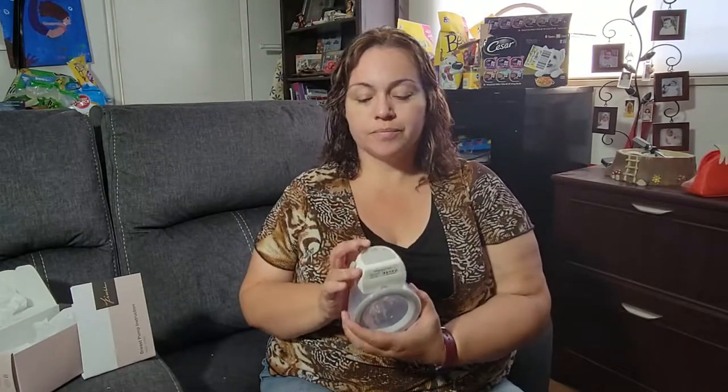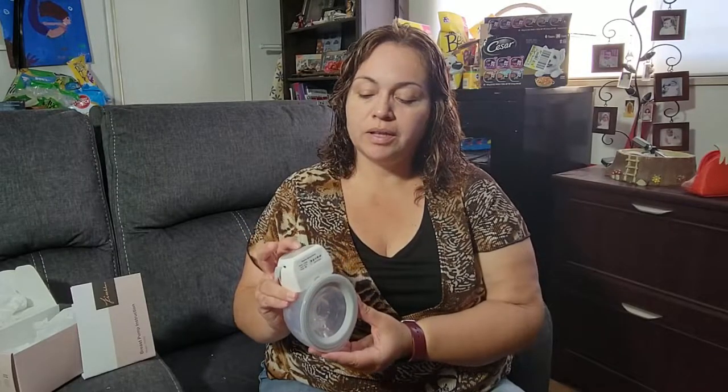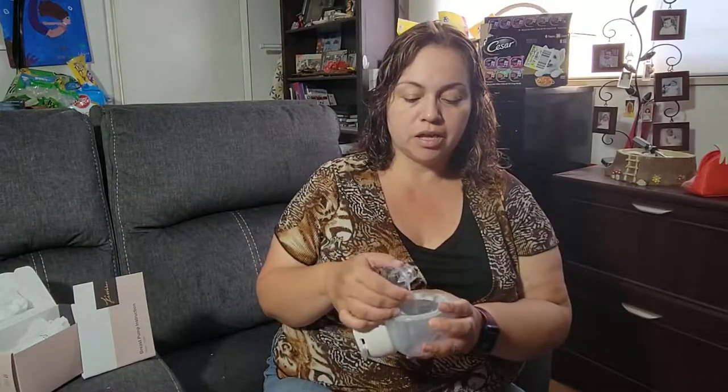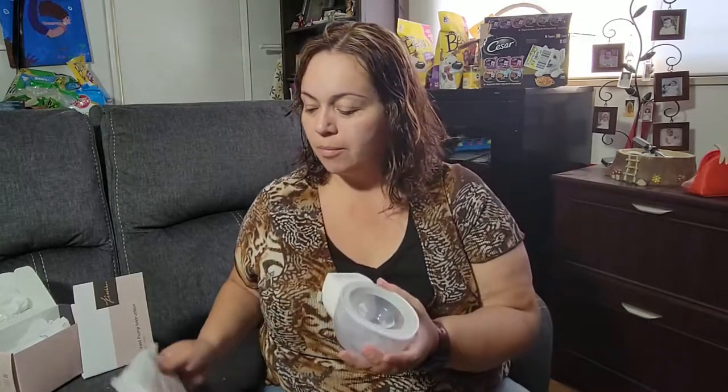It comes with the pump engine that you can start at a very low level and then increase if you want a little bit more suction. It also comes with the charging wire, as well as some extensions for your bra strap, which are very convenient. It also comes with extra accessories in case you need to replace the size before using it. It stores the milk inside this little capsule here, and then you can just put the top to close it and store it in the fridge. It also comes with little baggies if you want to store your milk, which is great.